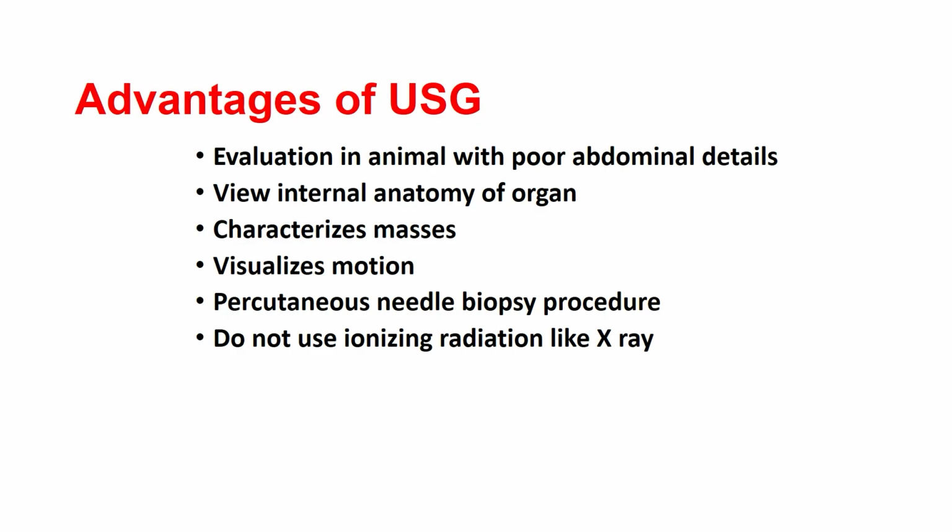Let us discuss the advantages of ultrasonography. Ultrasonography is used for evaluation of animals with poor abdominal detail. With its help, we can view the internal anatomy of the organ. With USG, we can characterize masses or tumorous growth.